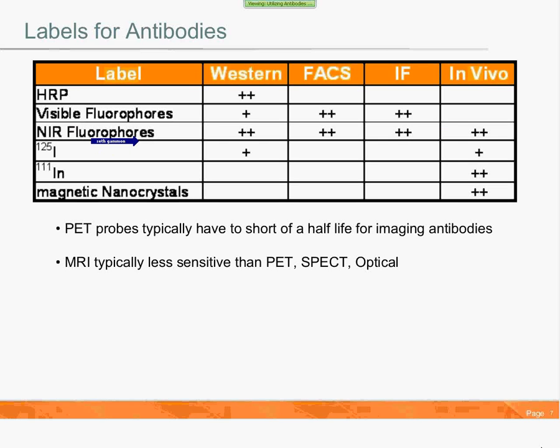And finally, there is a pro and a con with having very high affinity antibodies. While it's a pro that your antibody binds very specifically and tightly to the target site, this could be a problem if you want to re-image your in vivo probe at multiple time points. So, for example, I showed the antibody clearing away from the non-target tissues and staying bound to the target tissue. Well, that target tissue is now bright or positive in whatever imaging modality you want to utilize.